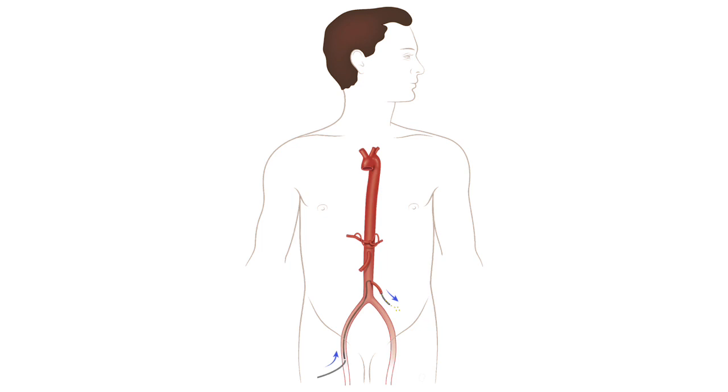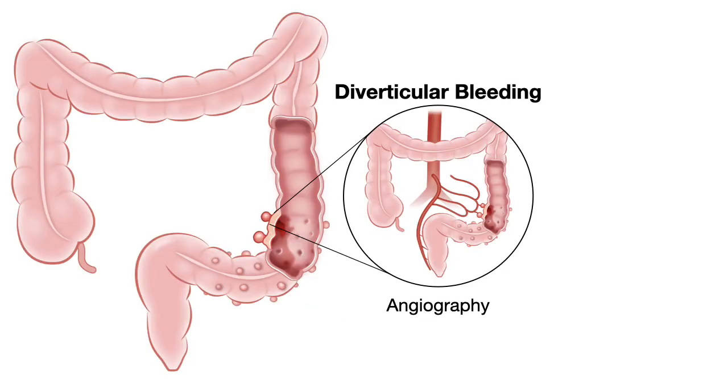And here is a femoral puncture and the catheter going into the inferior mesenteric artery because the suspicion was sigmoid diverticular bleed. And as you can see, this is a diverticular bleed from the sigmoid, selective catheterization of the branch that was causing bleeding, and that was marked by a clip during prior failed colonoscopic intervention.